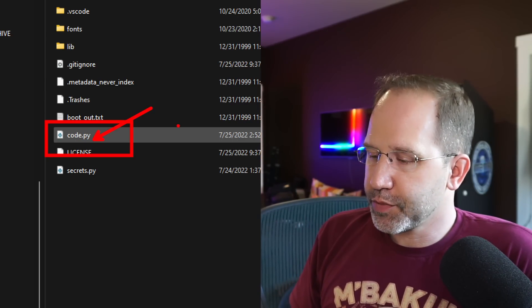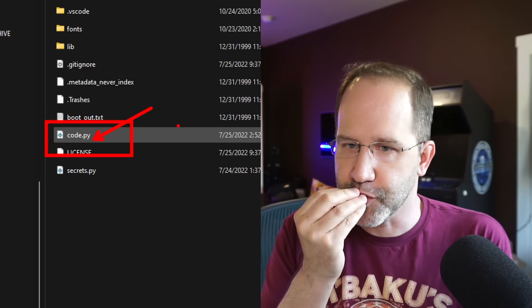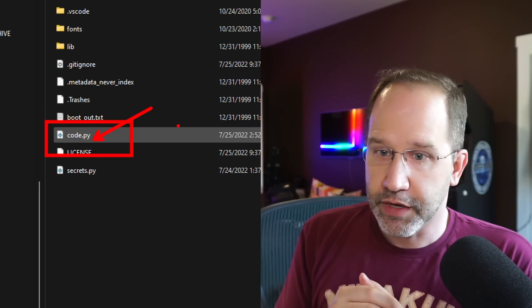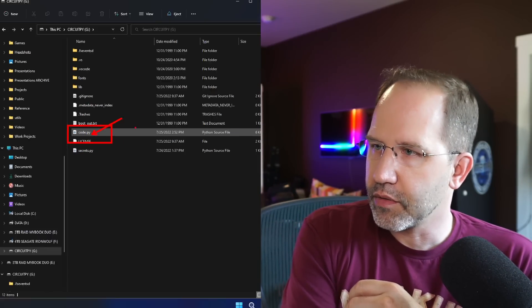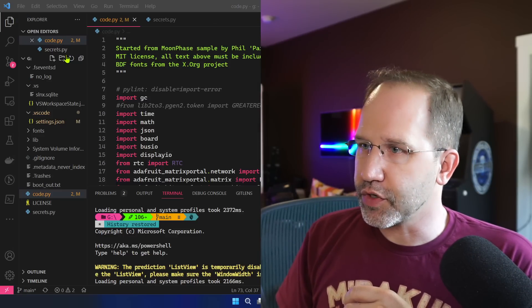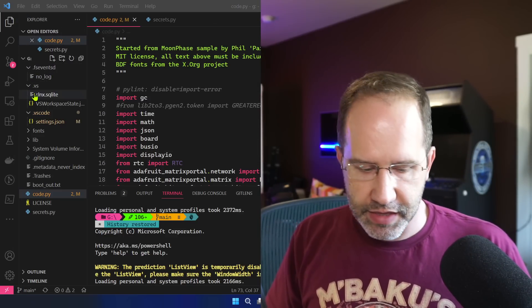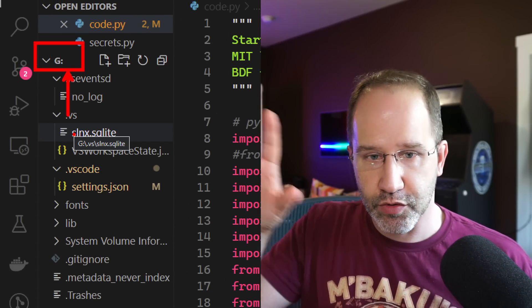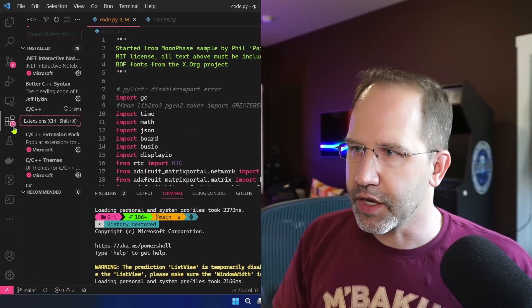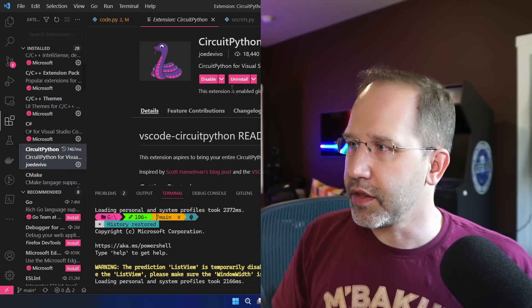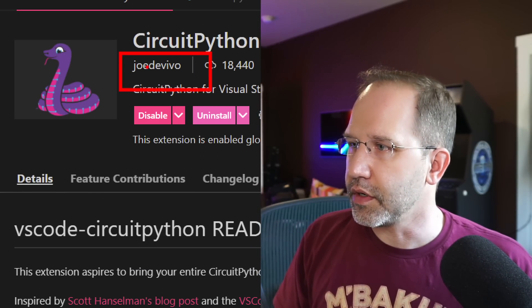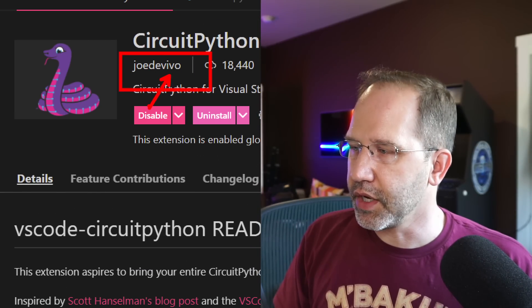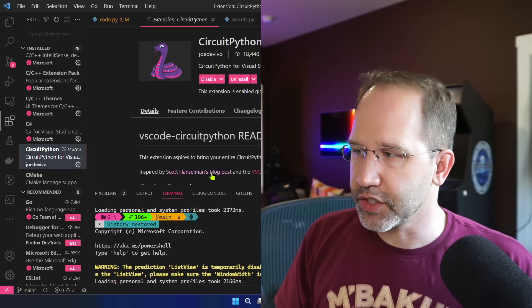From a learning how to code perspective, from getting started with IoT perspective, it's just genius, just chef's kiss. So I love this, it's wonderful. Then what I do is load that up into Visual Studio Code. I've got that directory, you see my G drive here is loaded up and I'm in that directory right now.